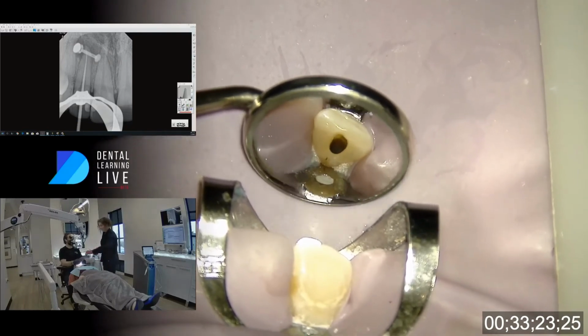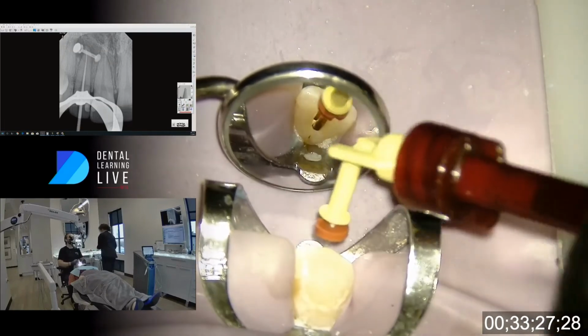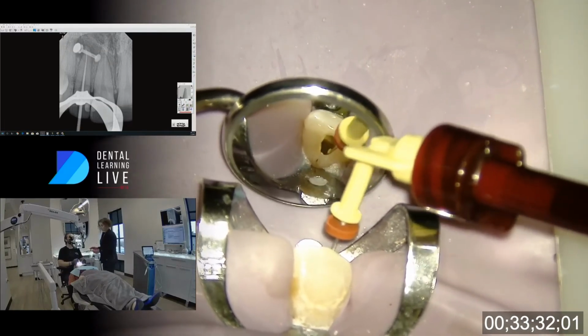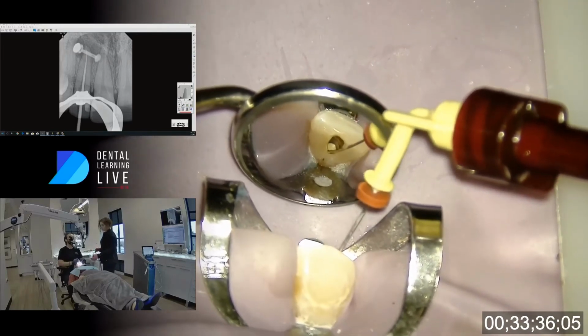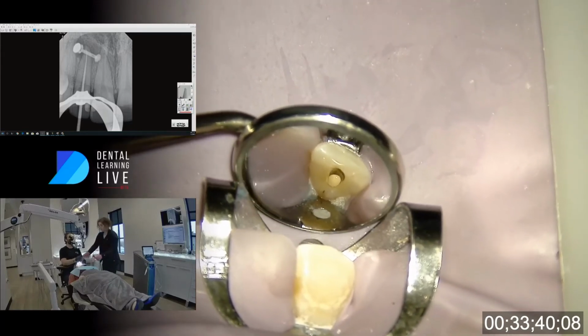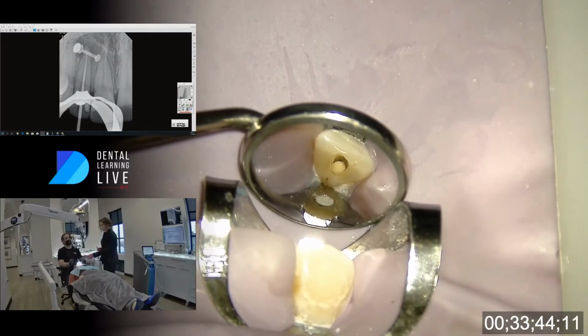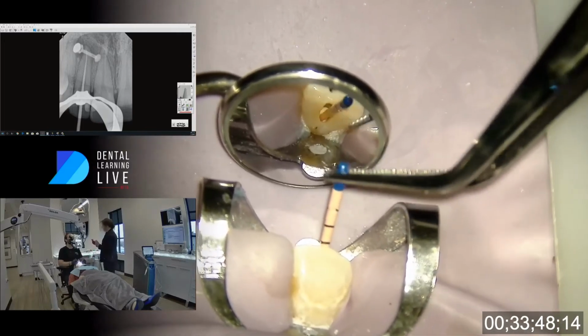Sealer? So I've got sealer in this compression syringe. This is actually an Ultradent compression syringe. And I'm just going to backfill the entire canal. My philosophy is I want this to go wherever it's going to go. It's minimally instrumented, and the EDTA does open up and remove any smear layers, so this will flow into whatever Mother Nature gives us.